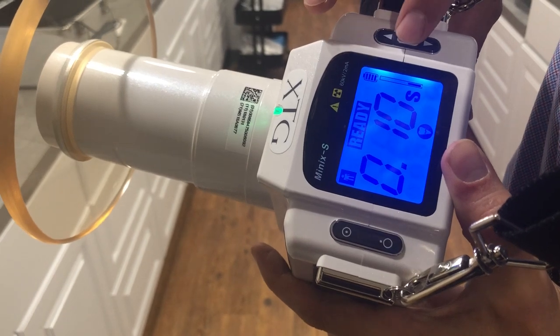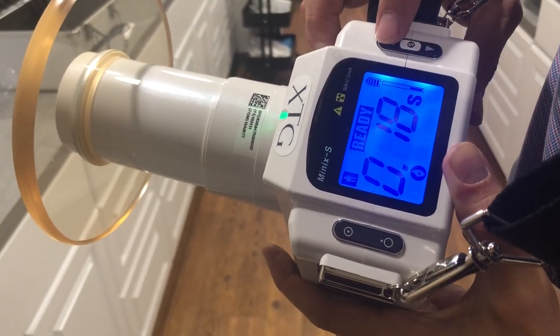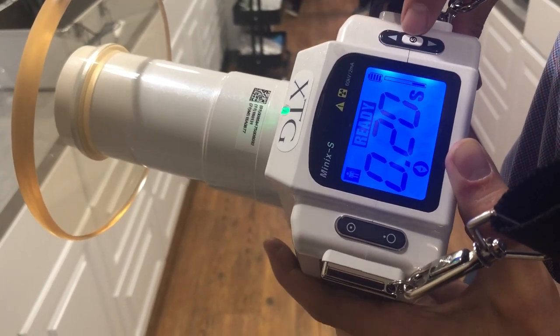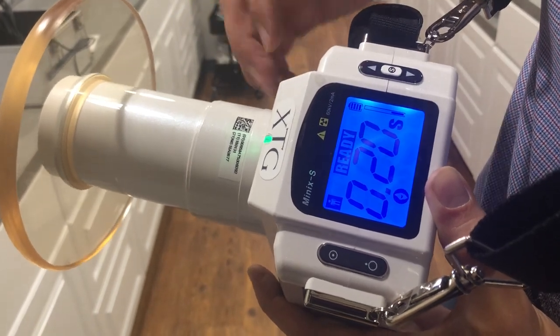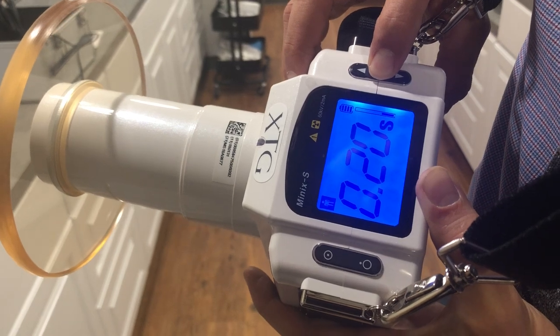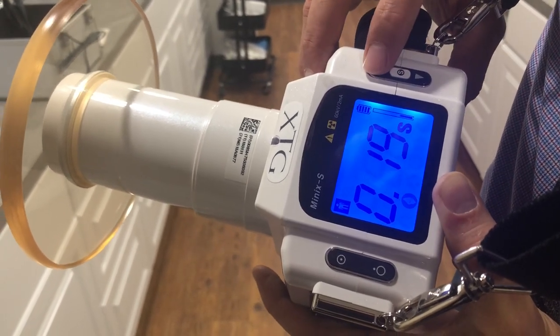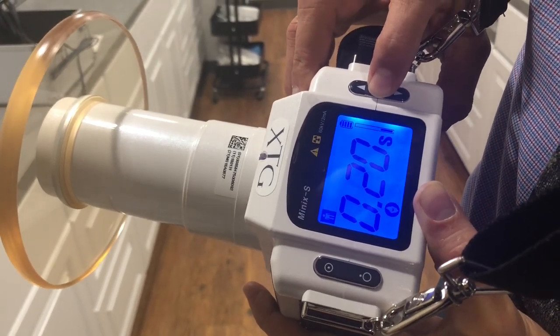All you need to do is touch the S button here and it'll cycle through the different tooth settings. If you want to change your exposure on the spot, just touch the arrow up or down. If you want to set that as your new preset setting, hold this button down for two seconds, adjust the setting, then hold it back down for two more seconds.